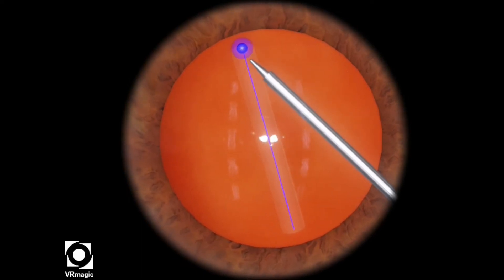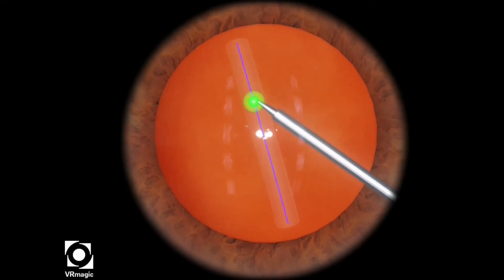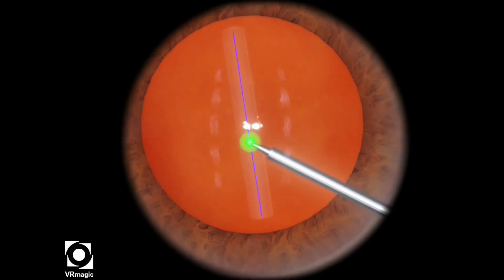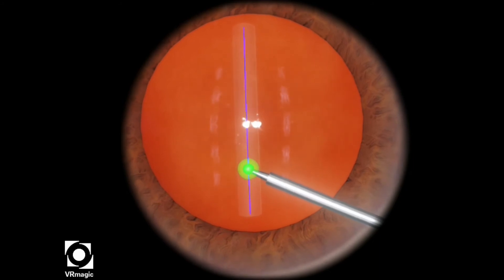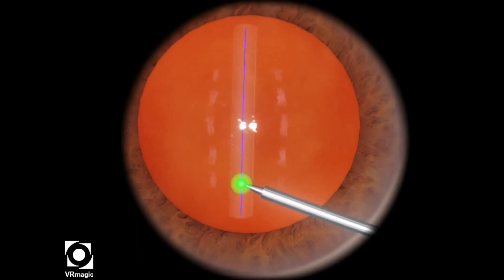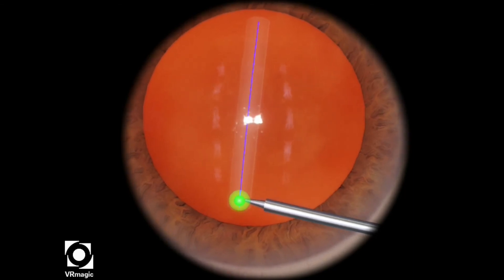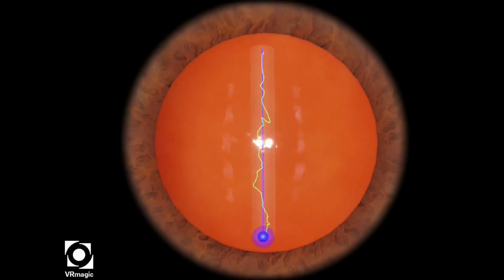Make sure the tip of your instrument enters the blue sphere and turns green — as you can see — and make sure it doesn't turn blue again. You do that by not letting your instrument tip escape the sphere as you trace the straight line. I almost escaped just now, but you're in the safe zone. Go to the end until the green sphere turns blue automatically.